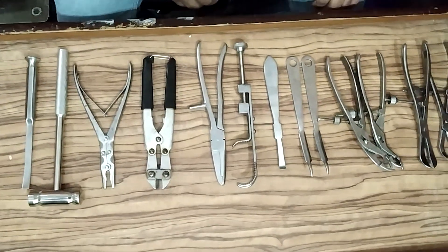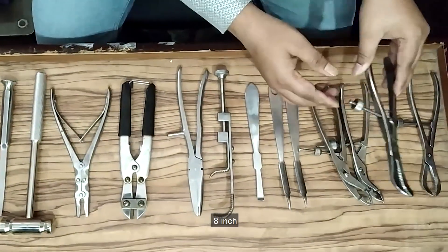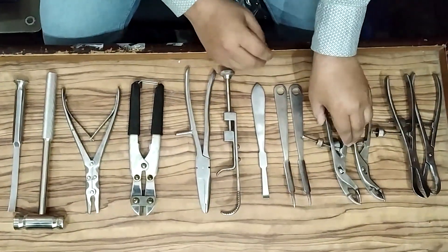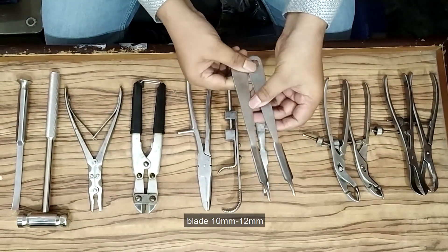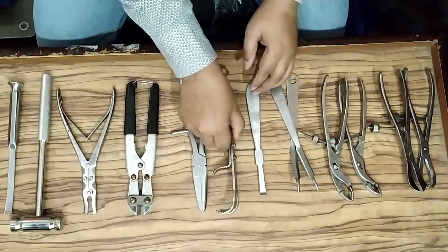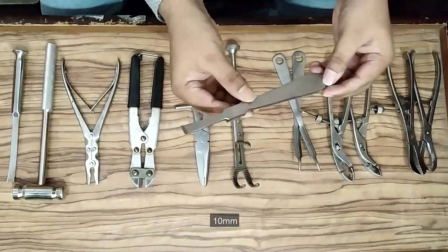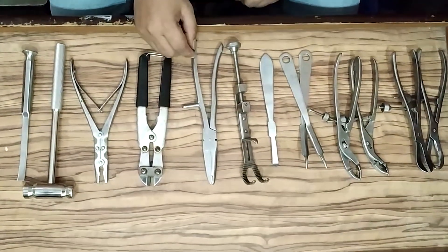General instruments: reduction forceps in pair, 8-inch in length.